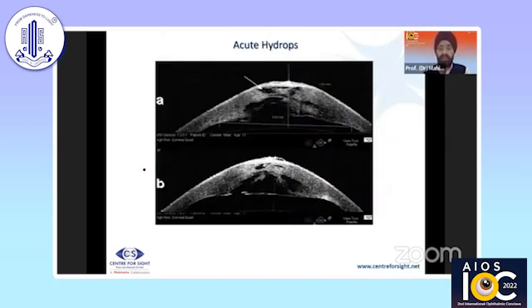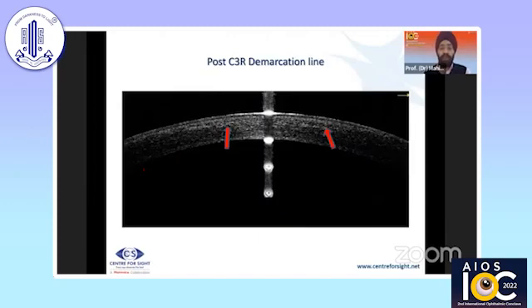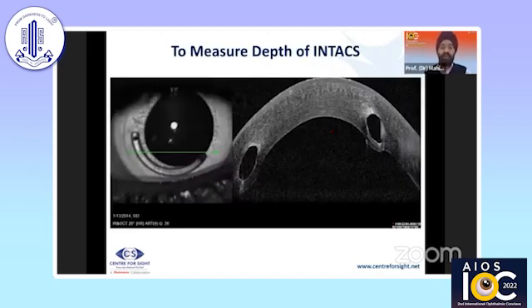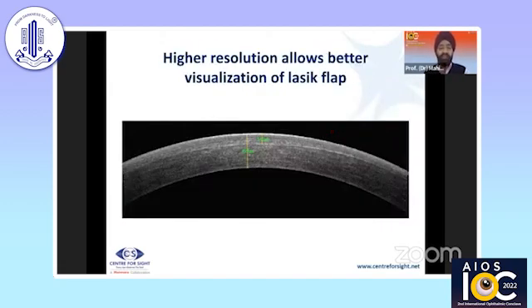Let us look at a case of keratoconus with acute hydrops. You can also look at the post-demarcation line of C3R — you can see whether there is a demarcation. This shows intracorneal ring segments as well.